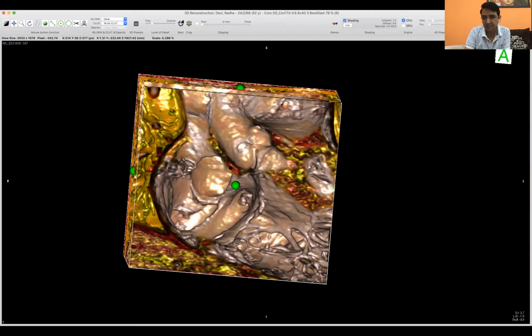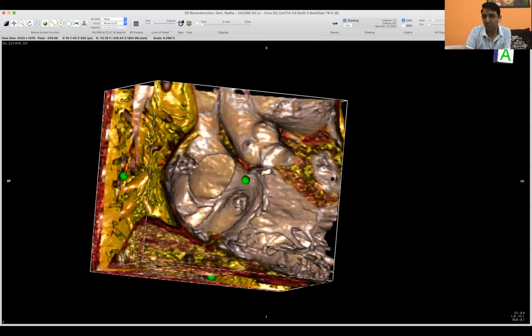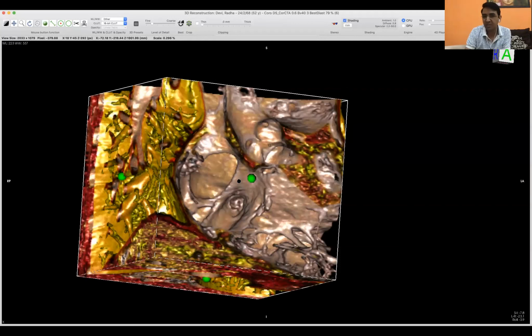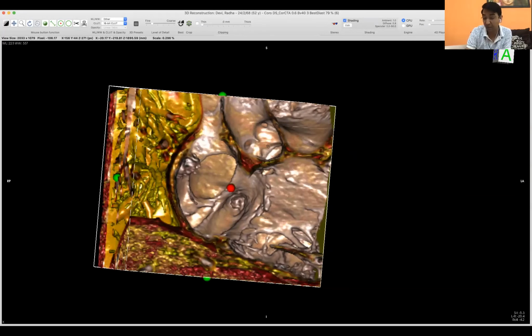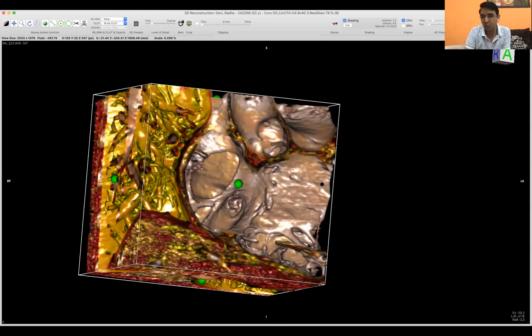As you would realize, this is the non-coronary cusp of the aortic sinus. This is the tendon of Todaro, coronary sinus again, and this is the ASD in the secundum location. Now, this is the SVC rim, but now we are not sure about the aortic rim. So, as we all know, the atrial septum is best profiled in the RAO view. Once we see that, now we are seeing the atrial septum in its entirety, and this is the rim which is retro-aortic.